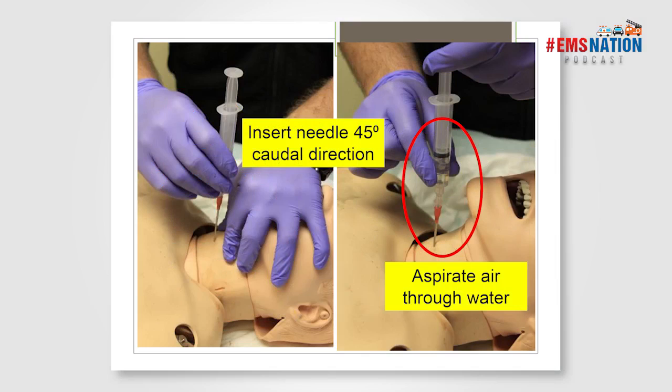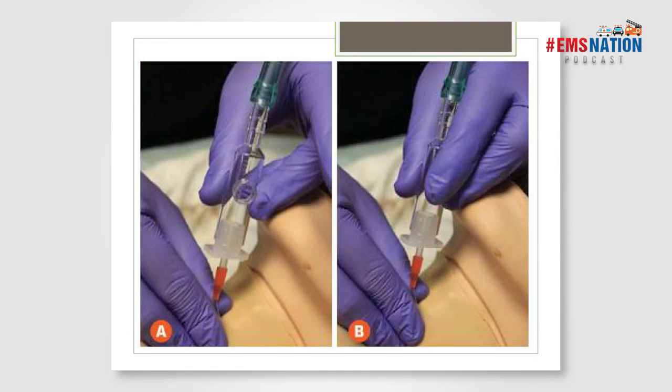into the trachea, I am aspirating so that we can all see the air bubbles as we aspirate the air inside of the trachea. I find having the air bubbles there as a visual cue for everyone lets people not just trust that, okay, I don't feel any pressure as I'm aspirating anymore, but we can all see as we aspirate there's a consistent flow of air bubbles, which is more likely to help us stay in the trachea.